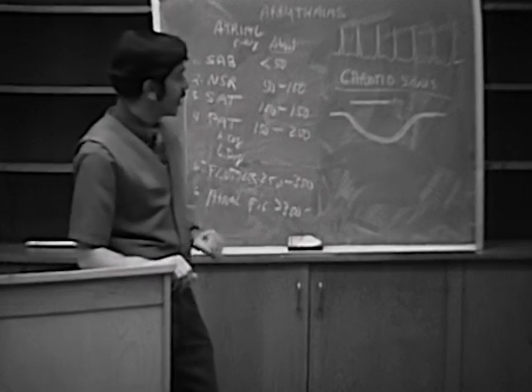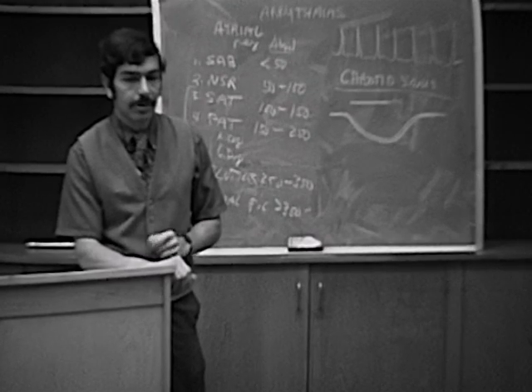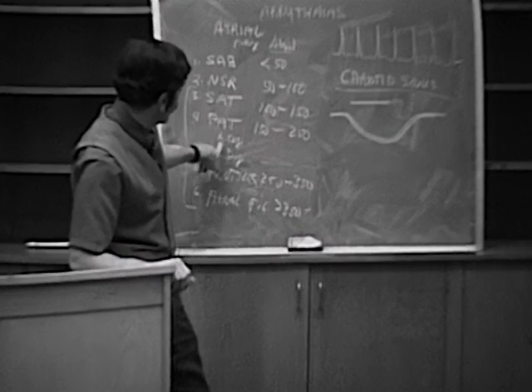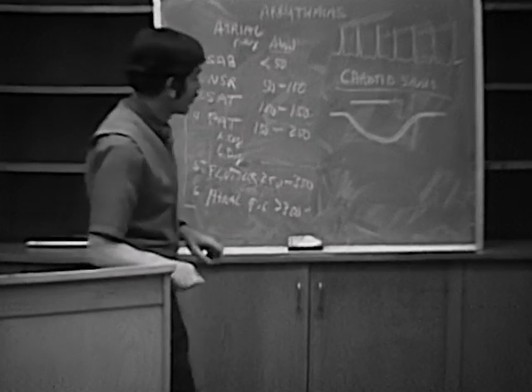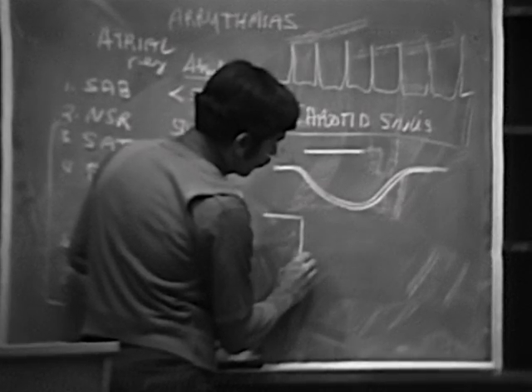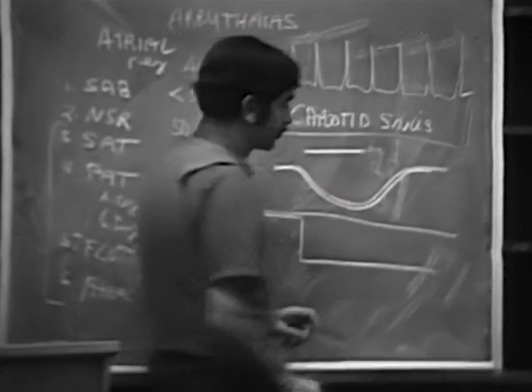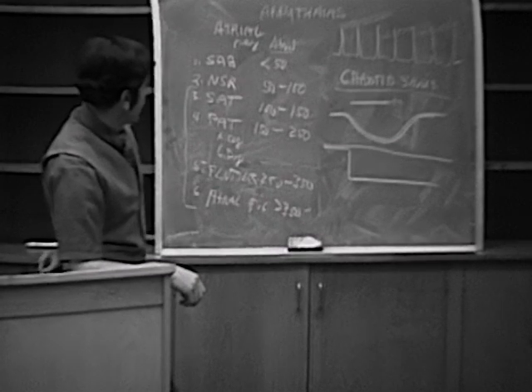Okay, now what happens with PAT? The same? No. And in the regular type of PAT, there's a difference between these two types of PAT. But in the regular type of PAT, you have either an abrupt response and a conversion thereafter to normal sinus rhythm, or you have no response at all. Right, this is the usual response then to PAT.